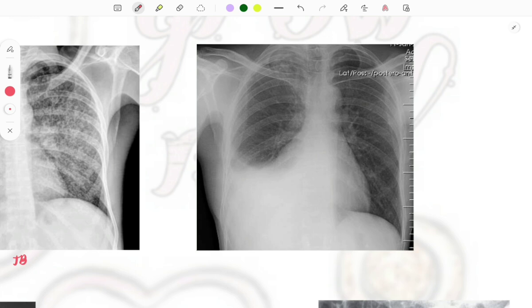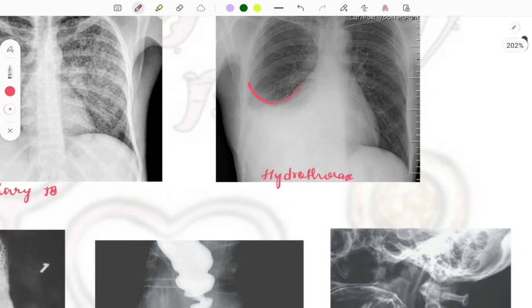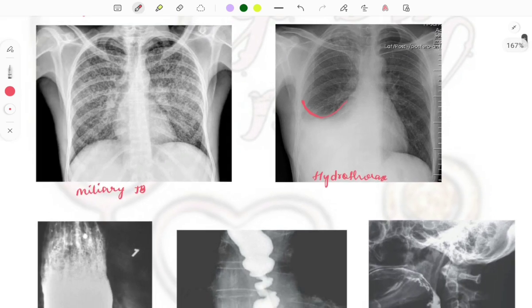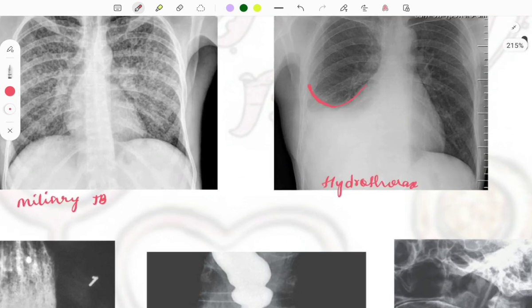The next chest X-ray shows the right side of the lung shortened with a characteristic curve — this is due to fluid collection, called hydrothorax. This is the classical image of hydrothorax. A similar appearance can be seen in pleural effusion, where pleural fluid collection produces this kind of image.